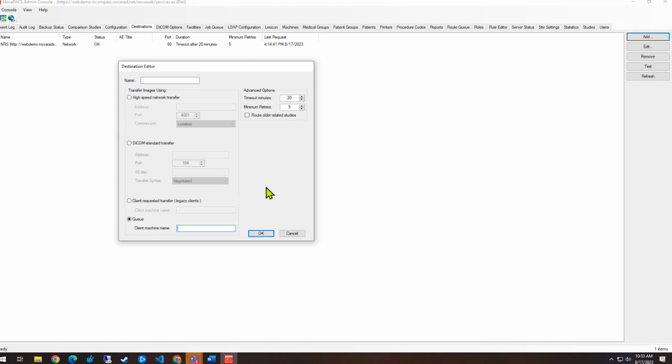As soon as the viewer is opened up, that viewer will then reach out to the PACS server and say, hey, this is my client name. Do you have anything for me? And if so, I will download it all right now. So it's very, very good for on demand.